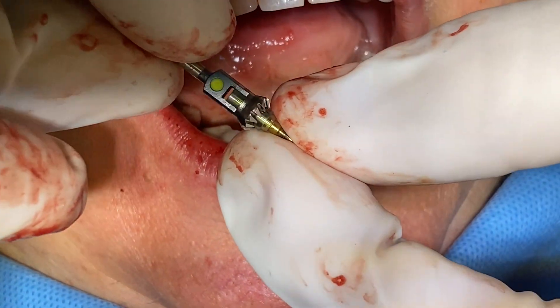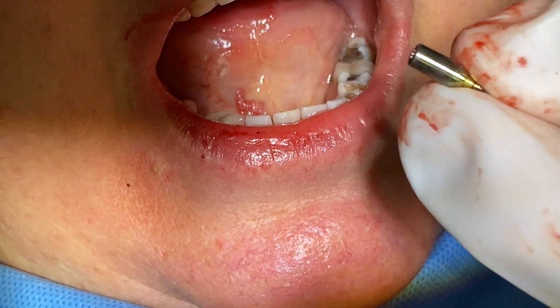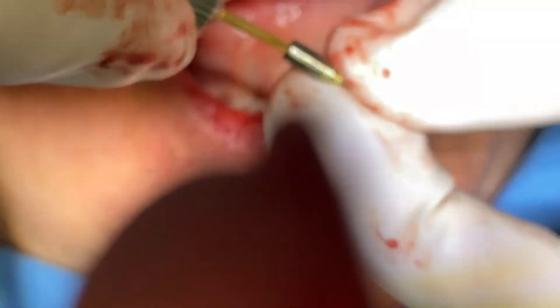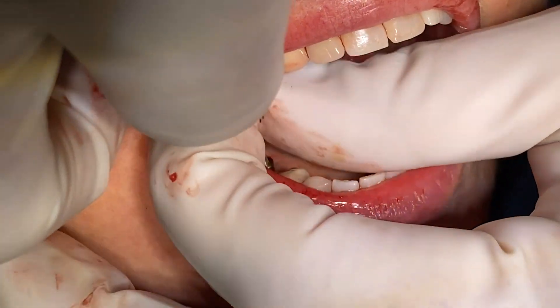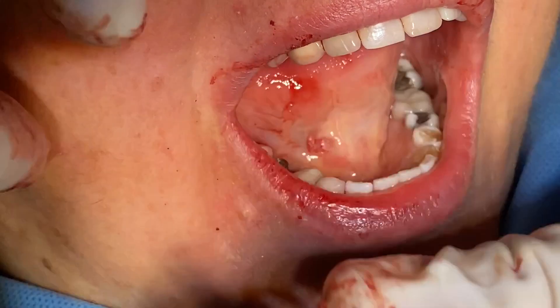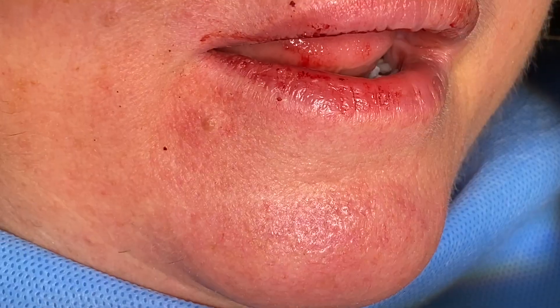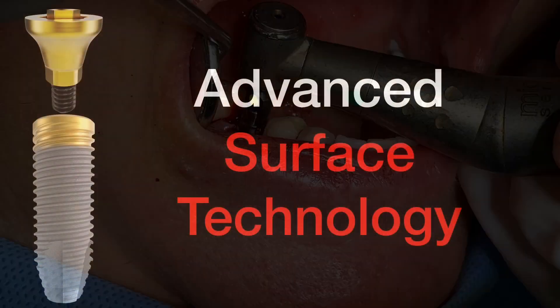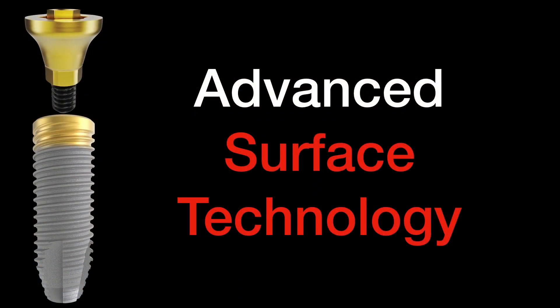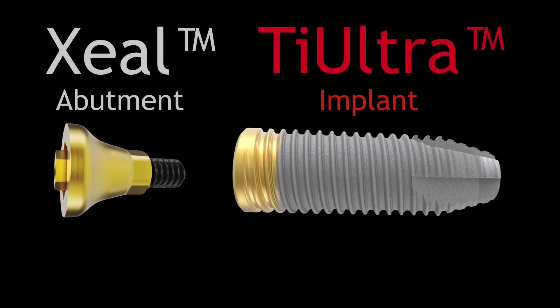Then we'll use a CC bone mill — it has a guide and then a mill that is kind of flared out. This allows you to place your abutments without any bone inhibiting the abutment itself. We'll use a CC bone mill on every CC implant we place to make sure the prosthetics are going to be positioned exactly where they should be. As we do this, we'll come in with the bone mill itself at a higher RPM. So we have a zeal abutment going into a TIE Ultra implant, and when these two come together, you're using different surfaces at different levels of the implant.